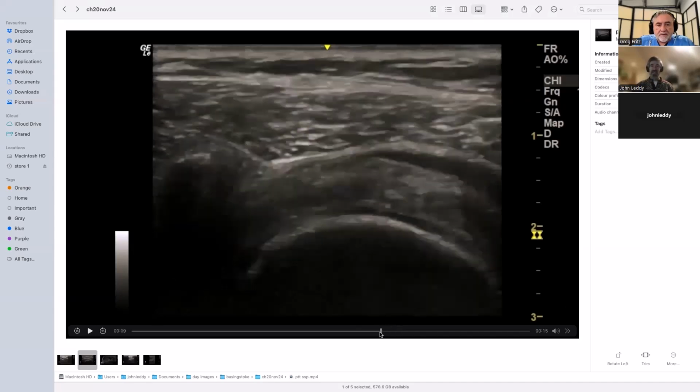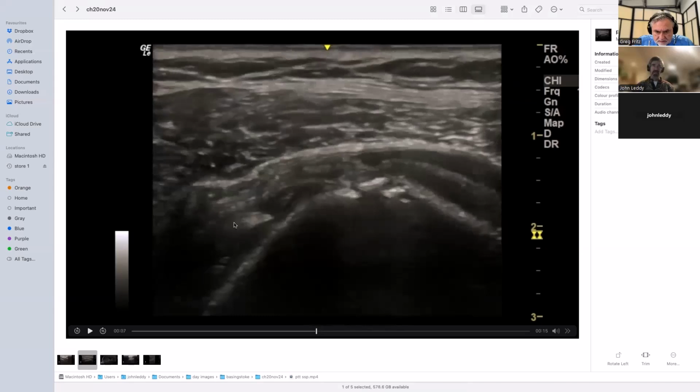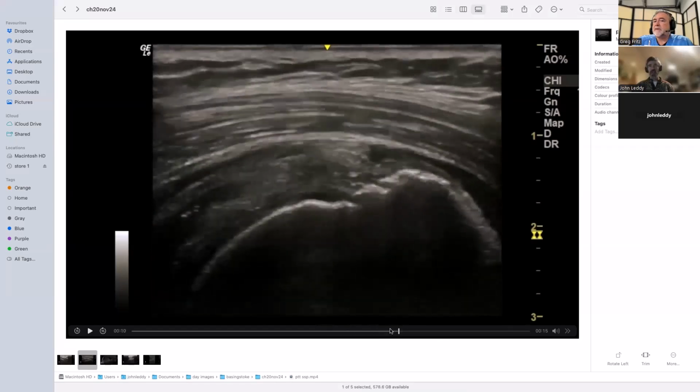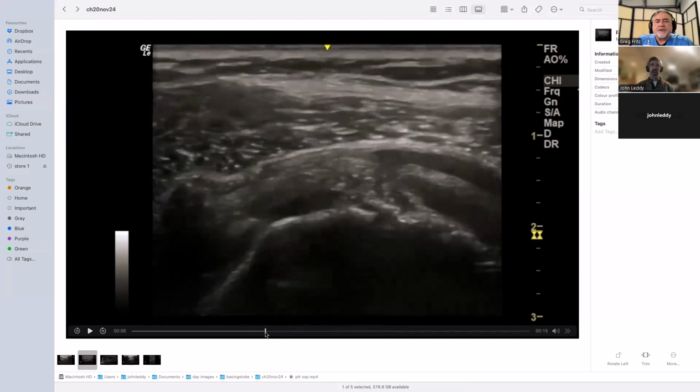And when you look in short, I haven't got a good view, but there's the biceps here, and the tear is just located here. So all this bit of tendon is all fine, and probably a little bit on the side here. So in terms of cross-sectional area, it's difficult because you don't know whether it's extending a little bit out to here, and there are those elements of deep and superficial tear. But you're going to have 80-90% of the tendon still intact, I would have said, by number of fibers.